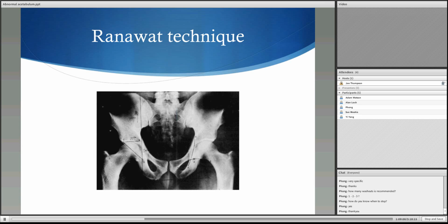It was cemented total hip replacements, both cup and femur. At 4 years of follow-up, it found that in 17 patients in which the cup was placed greater than 10 millimeters from the anatomical center had a high failure rate, whereas those that were placed close to the anatomical center had no failure. And they devised a technique of trying to determine where the anatomical position of the cup should be. And this is one of the images from the paper.